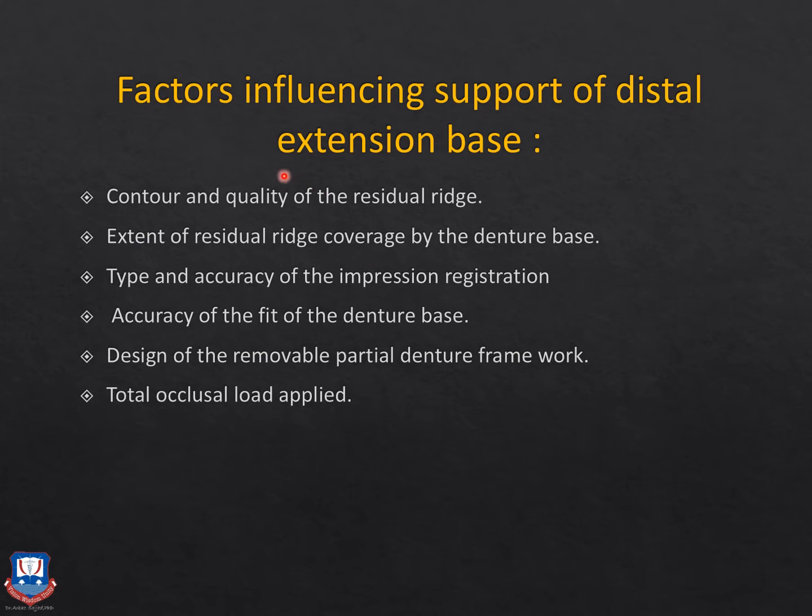So, first is the contour and the quality of the residual alveolar ridges. The second is the extent of the residual alveolar ridge that is being covered by the denture base. The third is mainly the type of the impression technique used and how accurately it records the denture bearing tissues. Fourth is the accuracy of the fit of the denture base.